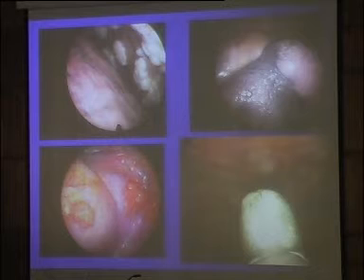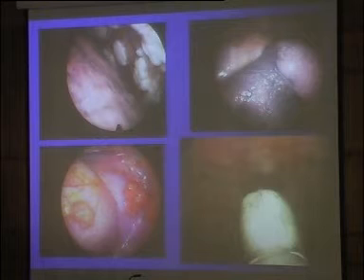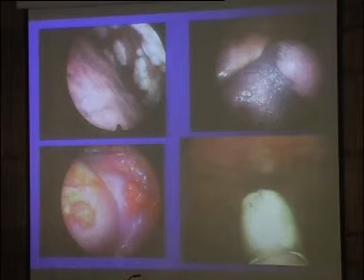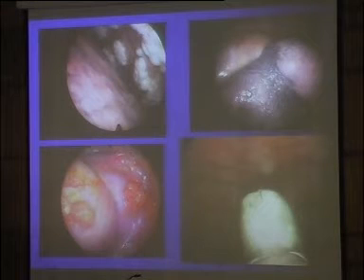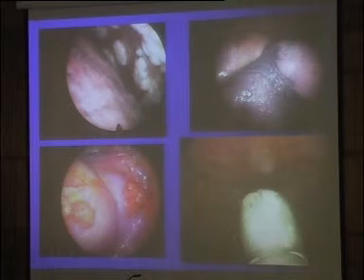nodule on the diaphragm. And it was very nicely shown by Cantor a long time ago in 1983, showing that in more than 60% of the patients, the nodules are located on the diaphragm, on the mediastinal pleura. And with blind pleural biopsy, you cannot reach this nodule. It's the first step. The second step is, of course, if you wait, as done by our colleagues from the United States, you can make the diagnosis at autopsy. For sure. And for sure, if you wait, if the nodules spread over all the pleural cavity, your percutaneous pleural biopsy will be fine, but in very late stage disease, too late.